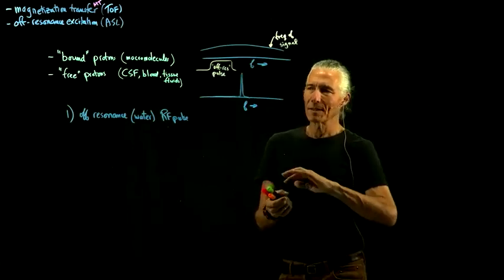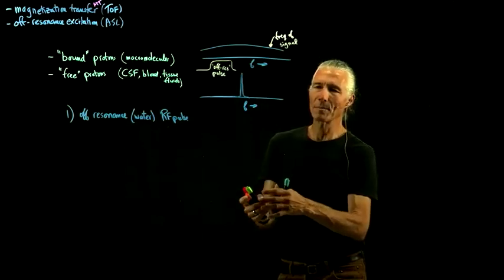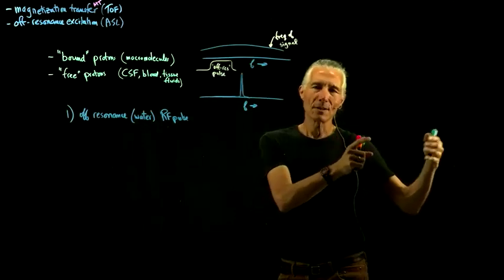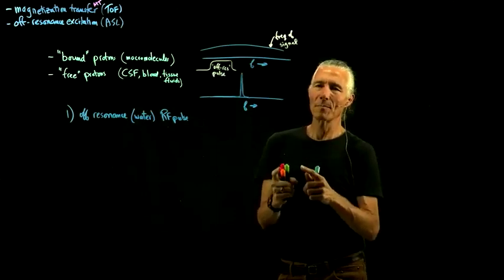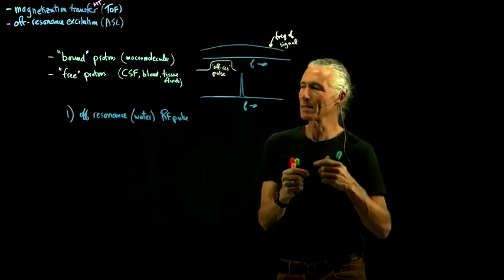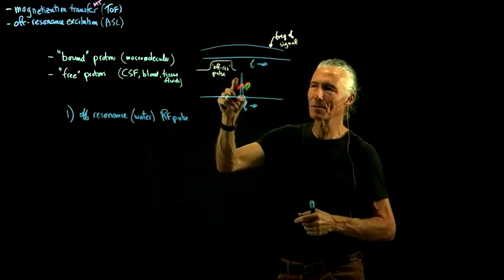It just conditions what kind of signal you're going to get out of it. So you do an inversion pulse, and then you do a 90 and do all the things you need to do to actually make an image. You can think of that as a whole module of its own. This preparation pulse will color the whole image in a particular way, and the off-resonance pulse is like that.